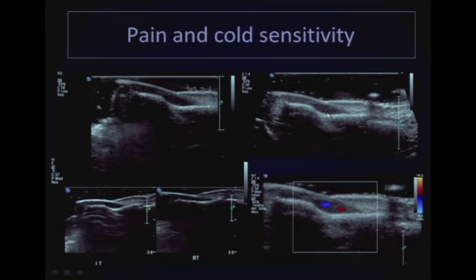Now I wonder, is this the normal contour of the bone, or is there scalloping or a pressure effect by this lesion? So we can see it here, the comparison between left and right. You'll see that I have some other examples showing comparison to be very useful. And now I think you can better appreciate that there is pressure effect on the underlying bone in the affected digit compared with the unaffected digit.